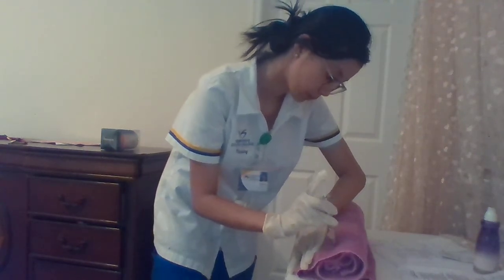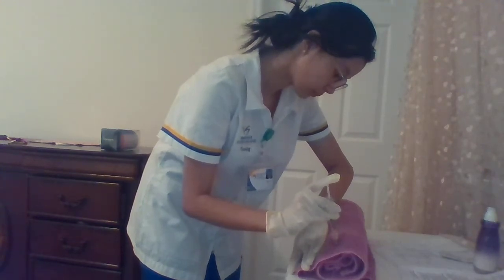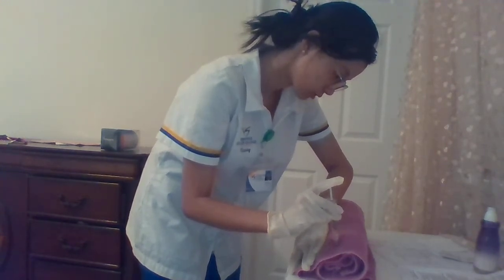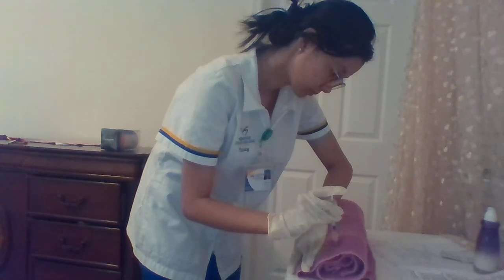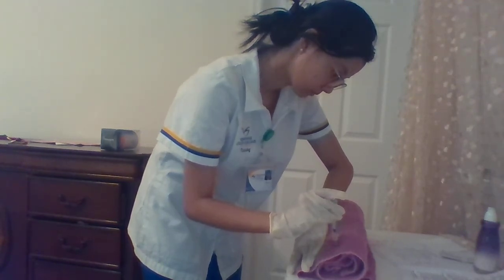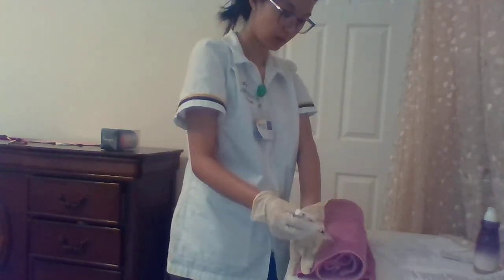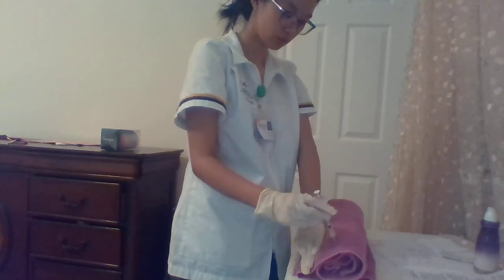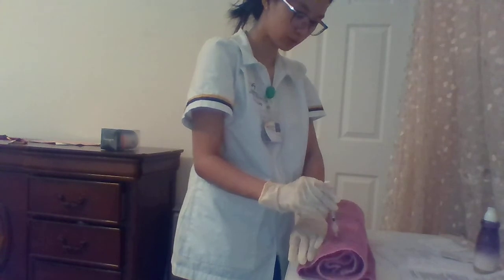And I am going to inject my medication really slowly, over 5 to 10 seconds. Okay. After I'm done with the injection, I am going to release the Z-track position.